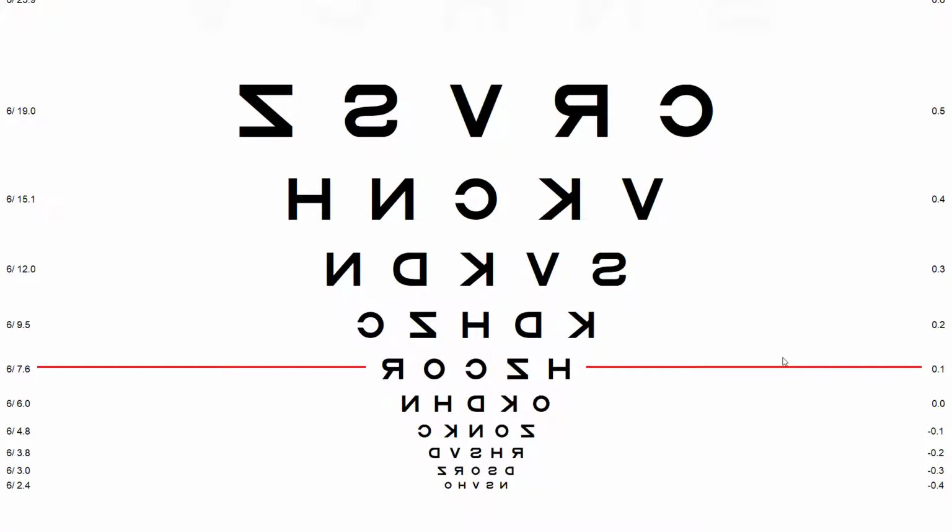The Thomson Test Chart can be used from any viewing distance and on any size display. However, we normally recommend you use a display screen of a minimum of 24 inch. 27 inches is good, but it can be used on any size monitor as long as you calibrate it properly.